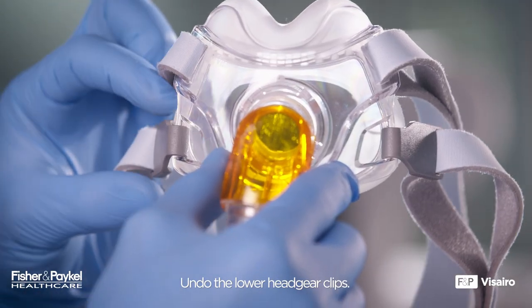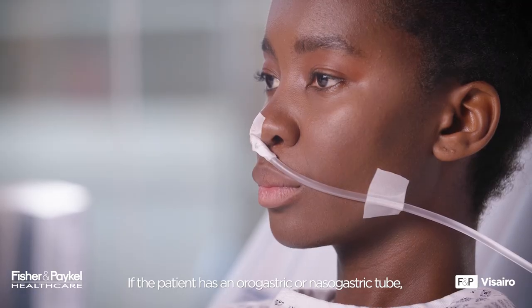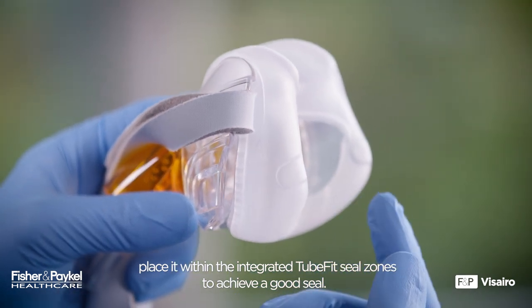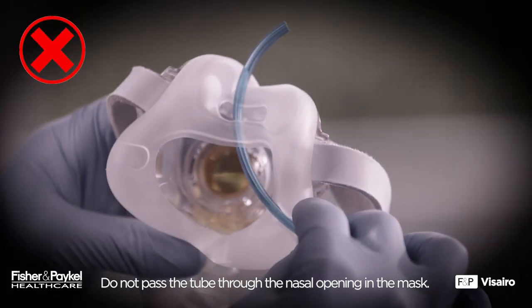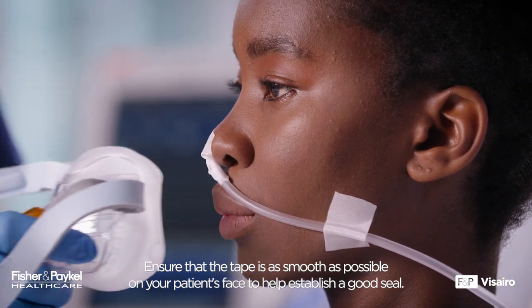Undo the lower headgear clips. If the patient has an orogastric or nasogastric tube, place it within the integrated tube fit seal zones to achieve a good seal. Do not pass the tube through the nasal opening in the mask. Ensure that the tape is as smooth as possible on your patient's face to help establish a good seal.